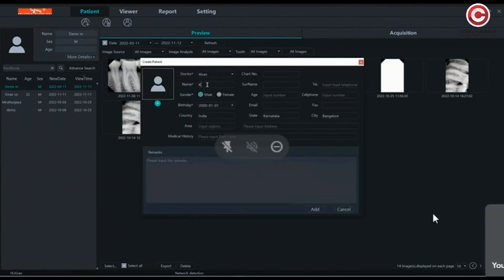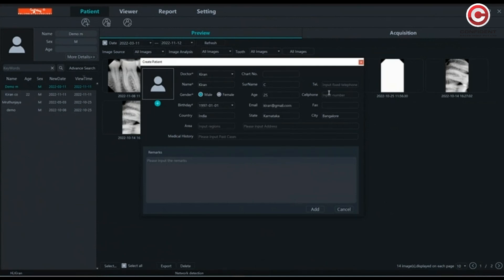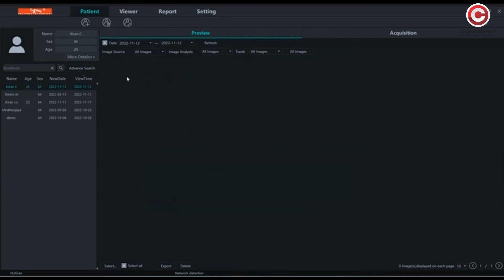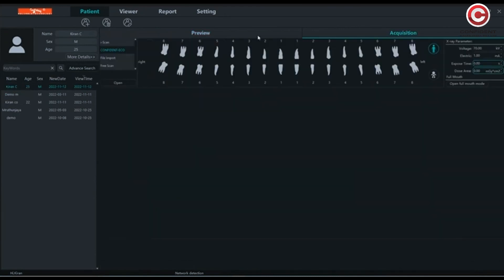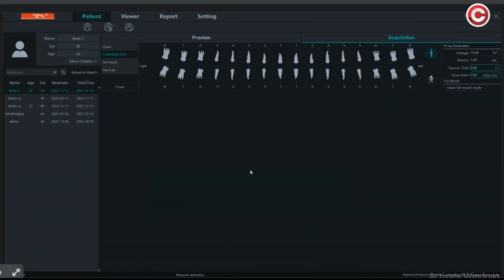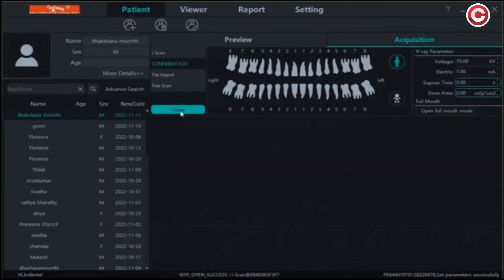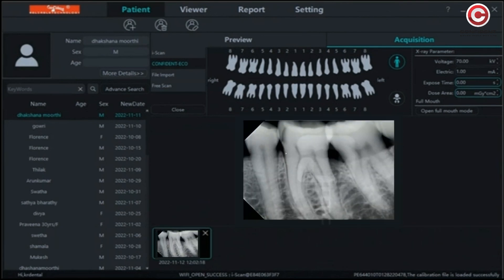In order to create a patient history, add all the required details of the patient. After adding, you can see the list of patients. Once you click on Acquisition, it will show the X-ray parameters along with the teeth set. There is an option to choose if the patient is an adult or a child. Select the tooth and click Open. The X-ray of the selected tooth is captured and saved in the list of images under the Preview tab.